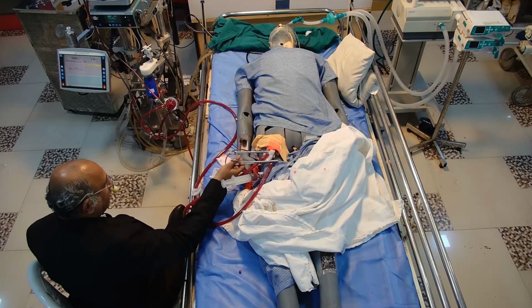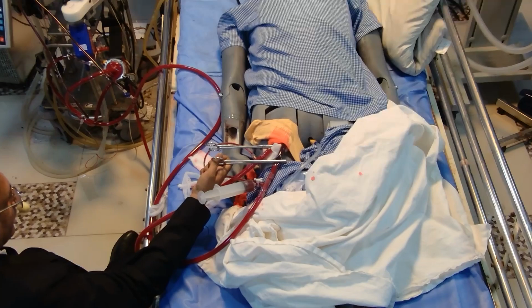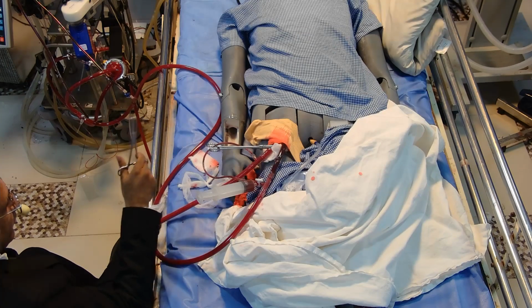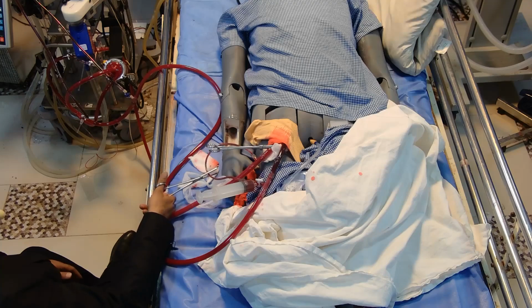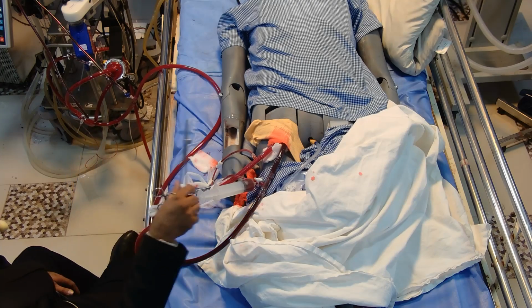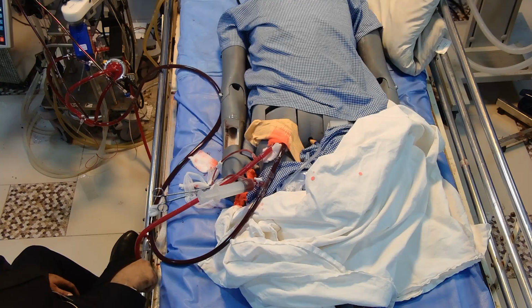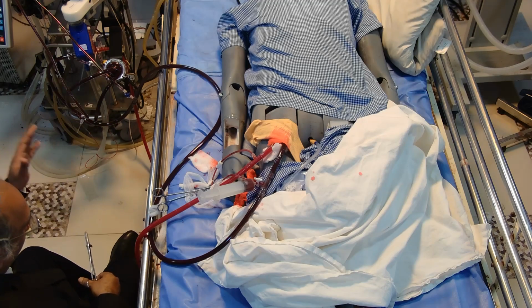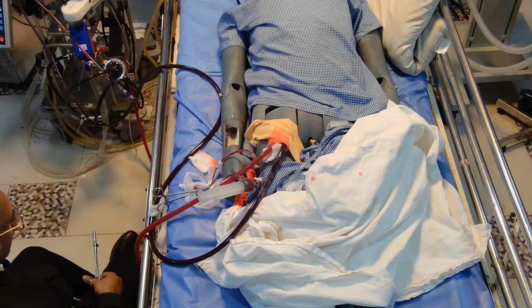Again, I am repeating the steps. When you want to go on ECMO, release the venous line first, clamp the bridge, release the arterial clamp. So you are draining now. You can see dark red blood, and your return is bright red blood, and that is what you have to do when you go on ECMO.